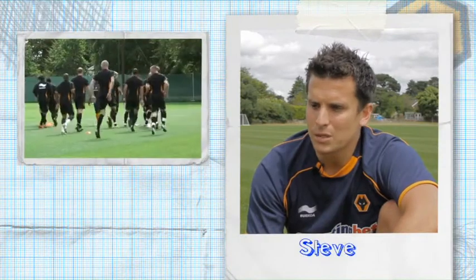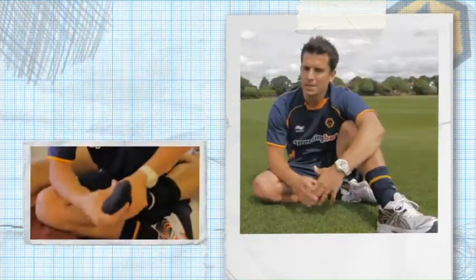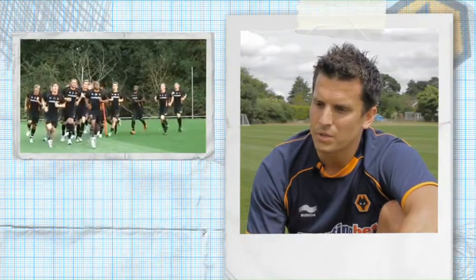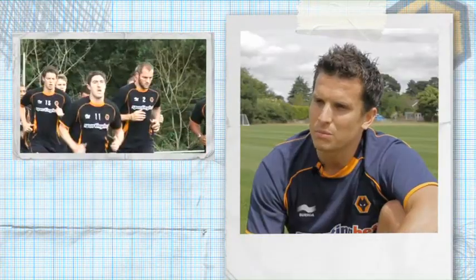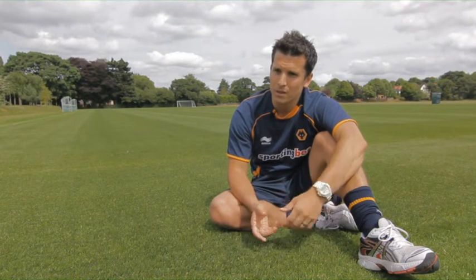Football is often a one-leg sport, so a lot of jumping, twisting, turning goes through one tendon. If the athlete has injuries or has weaknesses in different areas, the tendon may not function in its biomechanically correct position. Might develop microtrauma, which is tiny tears to the tendon, which is fine and the body will re-heal these if it's given time. If it's a professional athlete and he doesn't get time to heal, then that microtrauma becomes macrotrauma and develops injury. The scanner is very useful for those particular players.